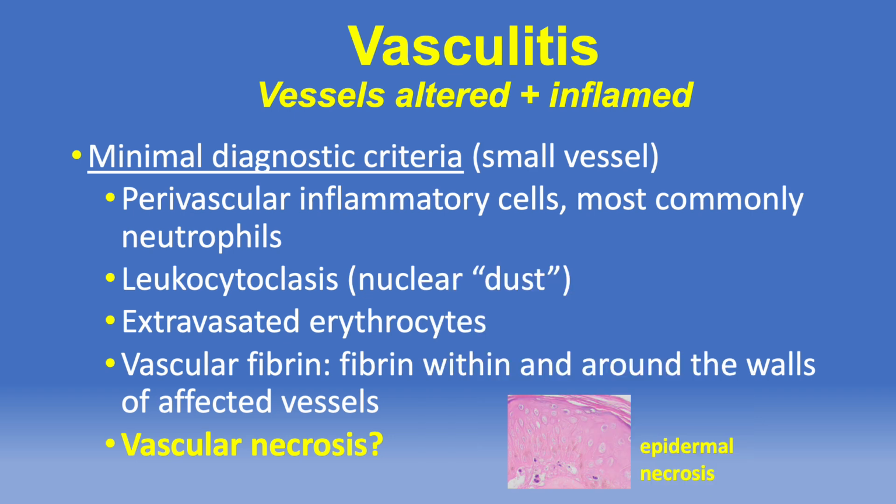In contrast, the eosinophilia of epidermal necrosis is more readily identified, where we have loss of the nuclear basophilia. But I think probably the biggest clue here is that the tissue architecture is more or less retained, where in vasculitis, the vessel wall can be completely obliterated.